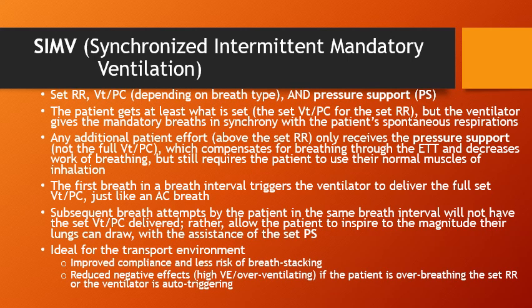So the mode that we really want to focus on and use in the pre-hospital and transport environment is SIMV, or Synchronized Intermittent Mandatory Ventilation. So in this mode, just like in CMV and AC, we are going to set a respiratory rate, and we're going to set a tidal volume or pressure control depending on what our breath type is.